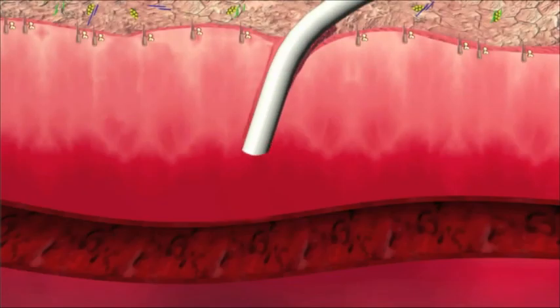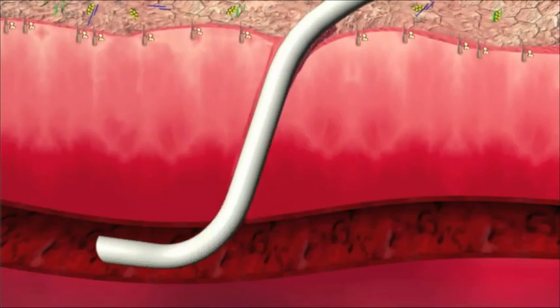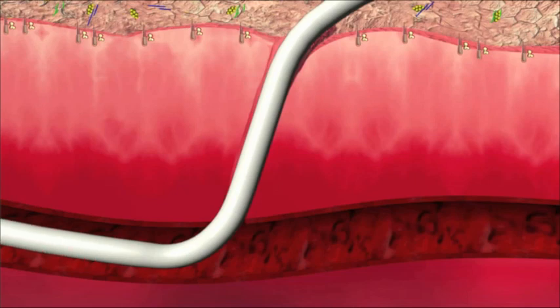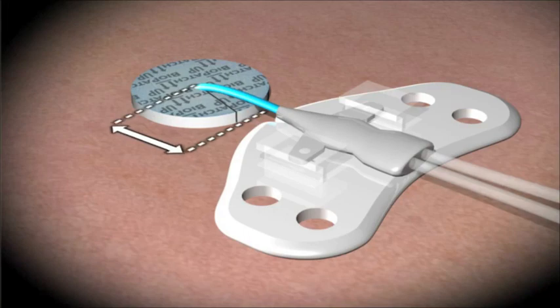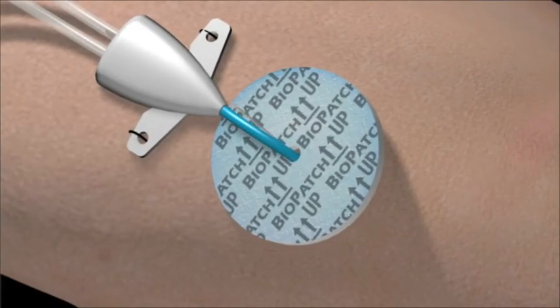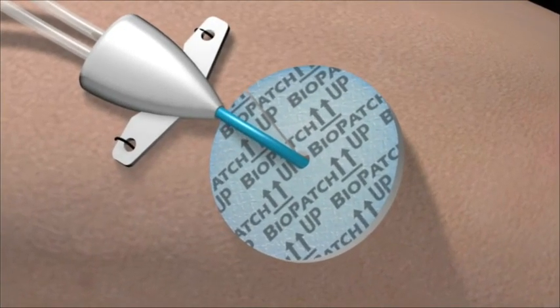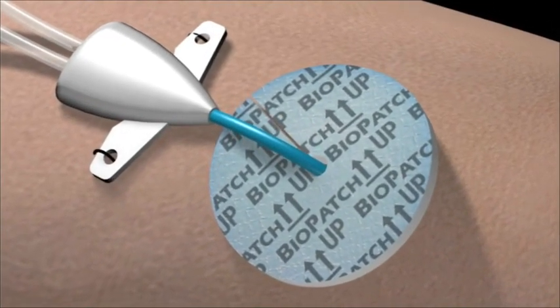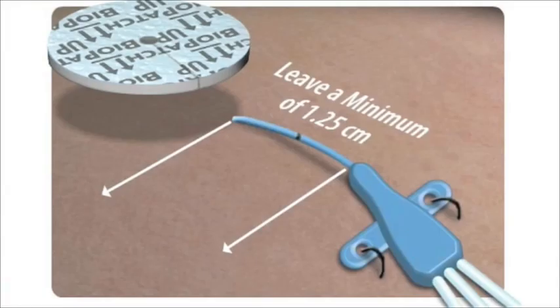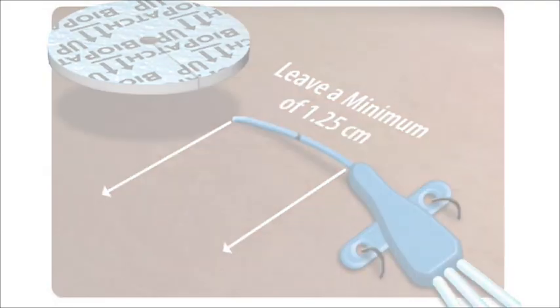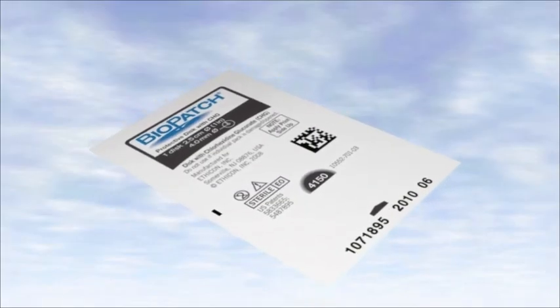Insert catheter into prepared skin area. When fixing the catheter in place with a suture or sutureless securement device, leave enough room for BioPatch to lie completely flat against the skin. Not leaving enough room will prohibit the BioPatch disc from 360 degree protective coverage. Leave approximately a half inch or 1.25 centimeters.